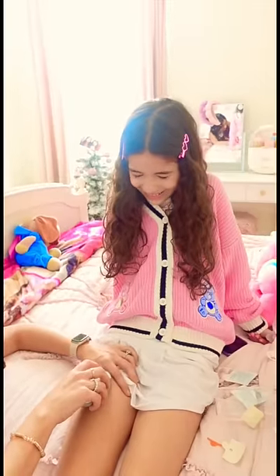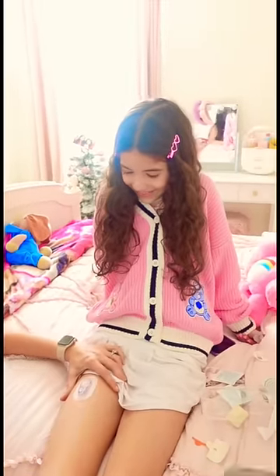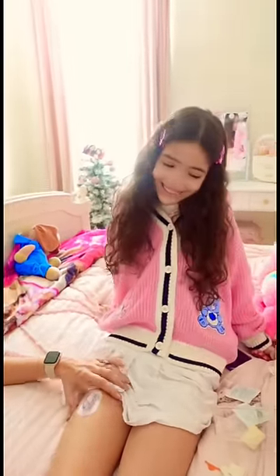It's time to put in the needle. Ready? Did it hurt? No, I didn't even feel it. You're so brave.